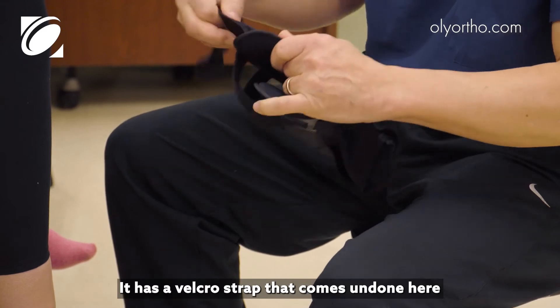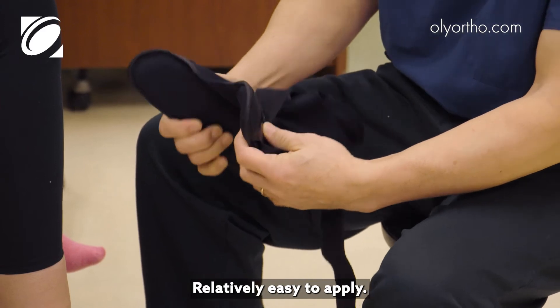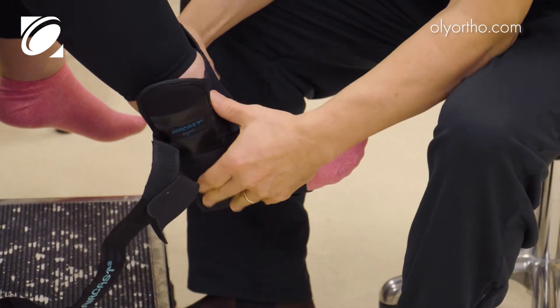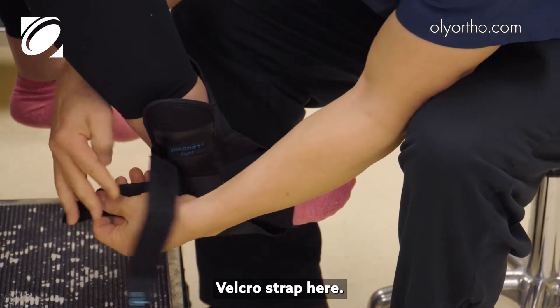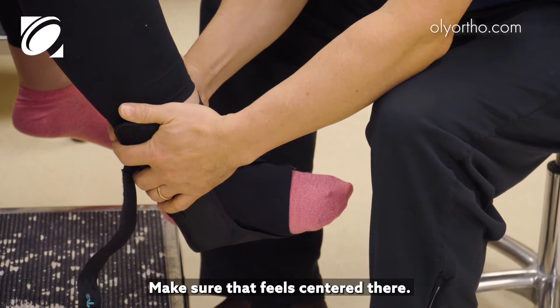It has a velcro strap that comes undone and a small strap on the back. It's relatively easy to apply — we just slide this on. It comes around, and the velcro strap here goes on the back, which helps make sure it feels centered.